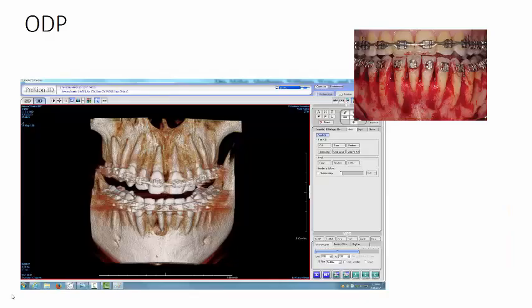We took a cone beam CT, and this is what she looked like. This visualization of the dehiscence of all the roots — although it's not completely accurate on a cone beam CT 3D reconstruction — you really have to go to the slices to get a more accurate perception of the amount of dehiscence. There's a definite pattern to these types of cases called ODP, Orthodontic Dehiscence Pattern. You can see that this patient was clearly overexpanded, and there's a generalized dehiscence of the roots that are significant. All these roots have been pushed past the limit of the alveolar housing, or the boundary.